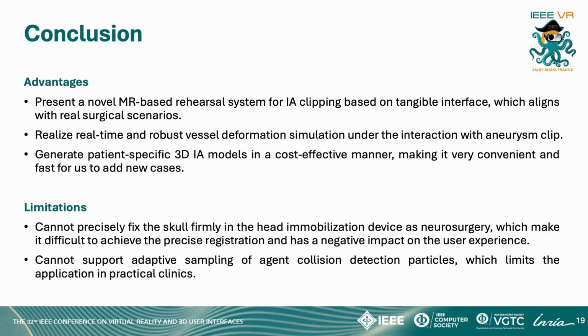In conclusion, we have developed a novel MR-based rehearsal system for aneurysm clipping, built on a tangible interface that closely mirrors real surgical scenarios. The system allows for real-time and accurate deformation simulations as the aneurysm clip interacts with the vessels. Additionally, it generates patient-specific 3D aneurysm models in a cost-effective way, making it quick and easy to add new cases. However, there are still some challenges pointed out by the surgeons. Our plan is to address these issues in future versions of the simulator to enhance its overall effectiveness.